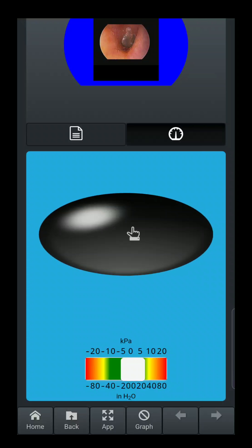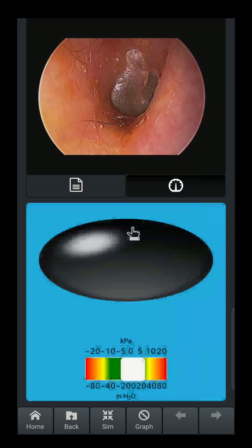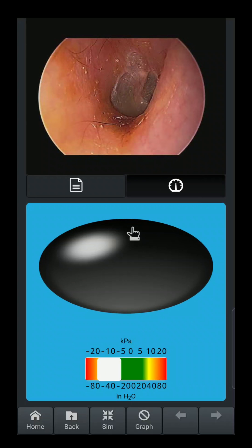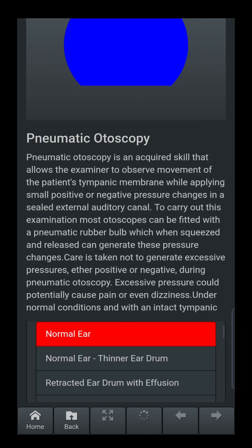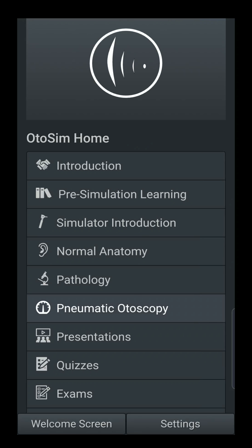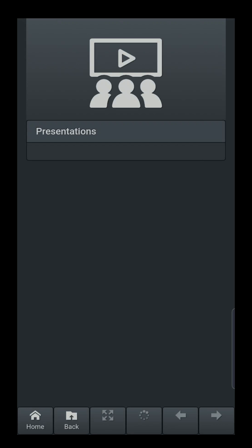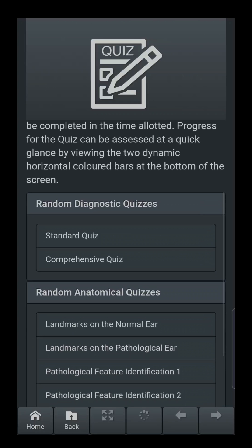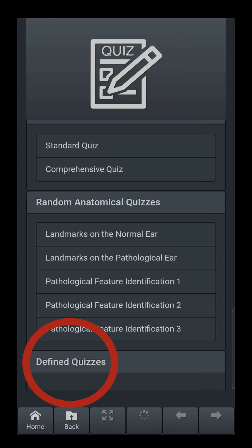You can also make the image bigger in app mode using the pinch technique. Going back to the main menu, under Presentations — if your instructor has created a presentation for you using the portal, it would appear in this section. If there are quizzes created by your instructor, they would appear in the defined quizzes section. In this situation there are no defined quizzes.